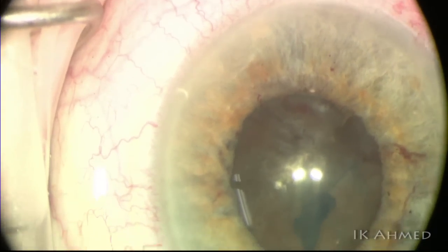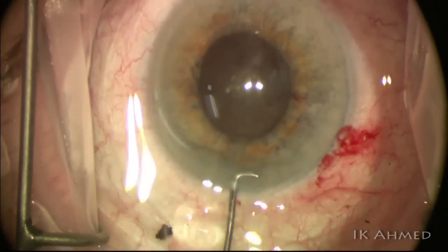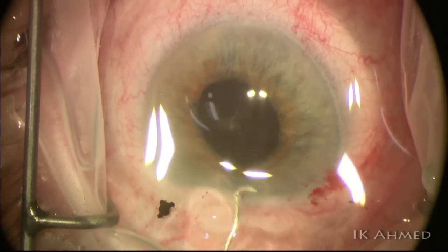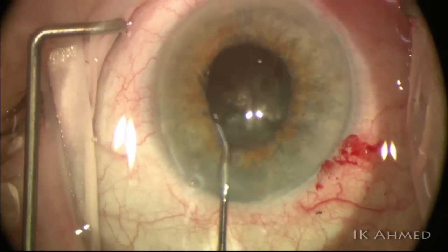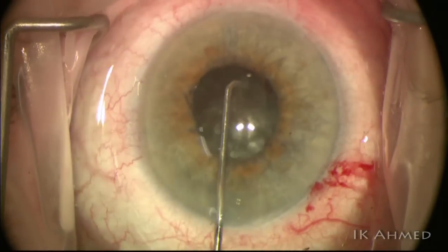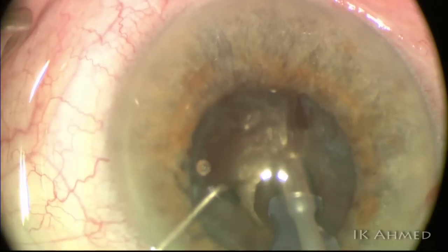In some cases with pseudo-exfoliation syndrome, we also see this capsular splitting phenomenon. Once we've completed the continuous capsulorrhexis, we release some of the superviscous cohesive agent and inject with the hydrodissection cannula to help separate the cortex and capsule. There's not much cortex present in these eyes, but it is still helpful to do that.